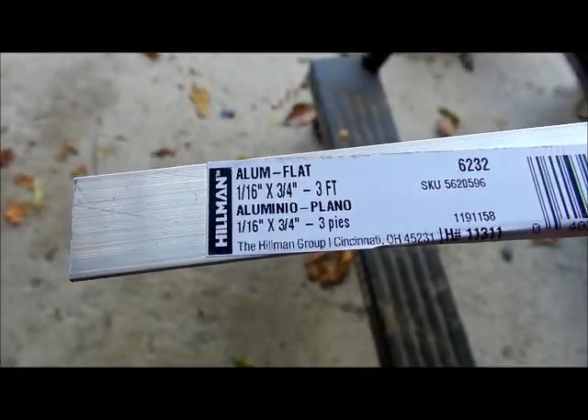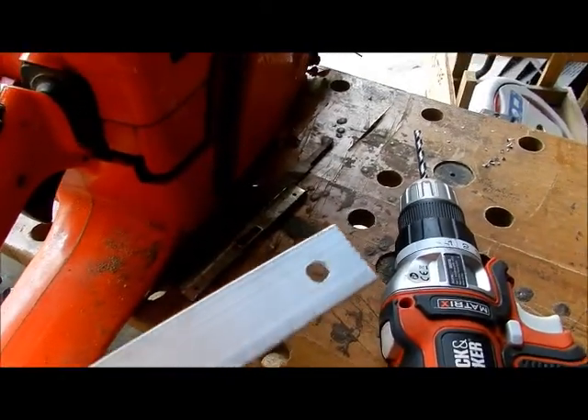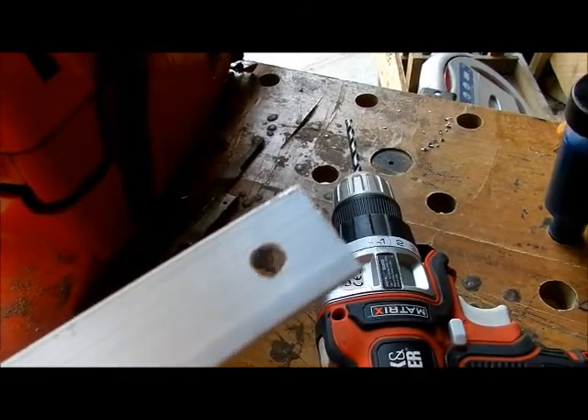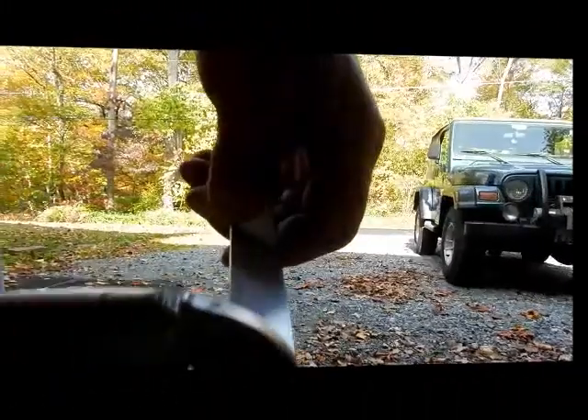It's aluminum — one-sixteenth by three-fourths. Three feet gives me a lot of room; I could probably make these for other people. I measured the size of the screws, and I think the screws are all different anyway, so check the size and drill a hole not too far away from that end.